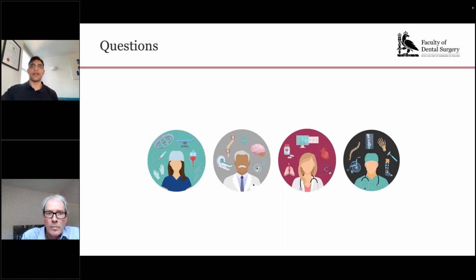Now, the other thing you have to bear in mind is the patient's perception. If you're in a clinical setting and the dentist produces what looks like a fit for purpose camera assembly and they're taking clinical photographs, then that gives a very different perception to if they whip out an iPhone, irrespective of what kind of flash system they've then put onto that. So I think that does have an impact, and we should be conscious of that. So I would always go for a proper camera system and assembly.